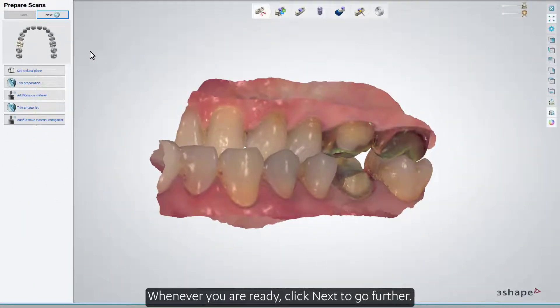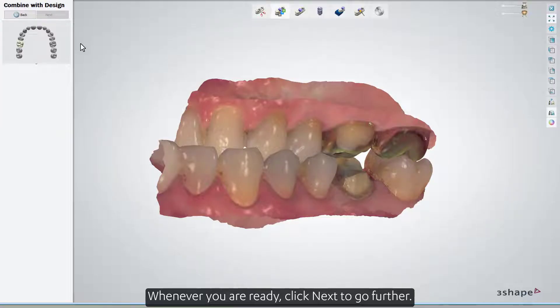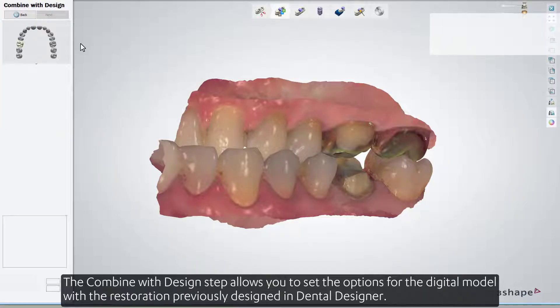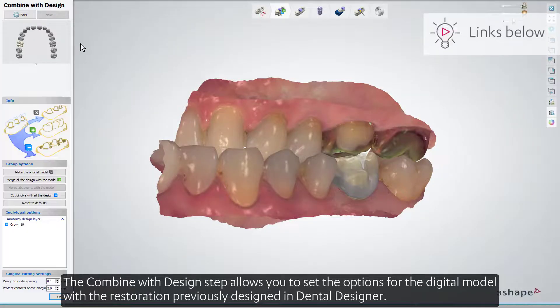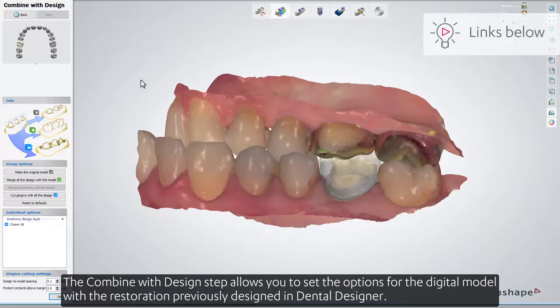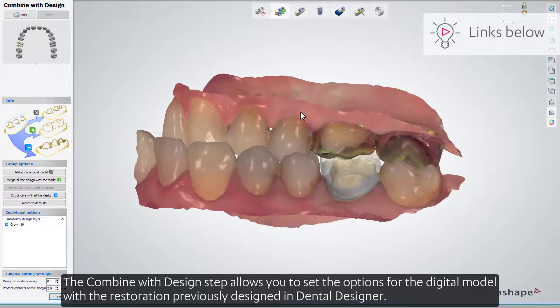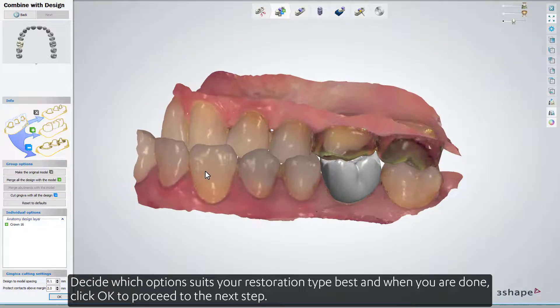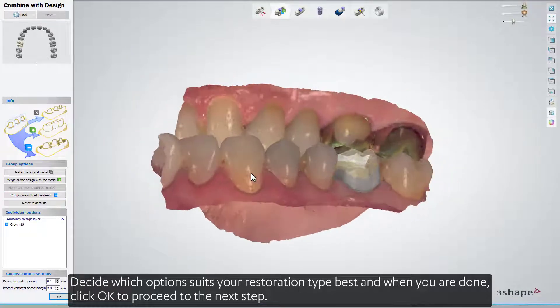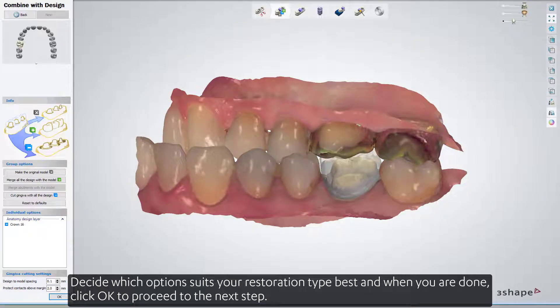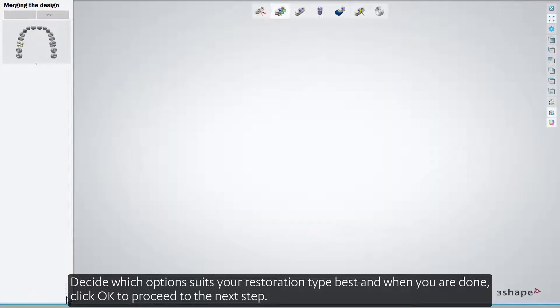Whenever you are ready, click Next to go further. The Combine with Design step allows you to set the options for the digital model with the restoration previously designed in Dental Designer. Decide which option suits your restoration type best, and when you are done, click OK to proceed to the next step.